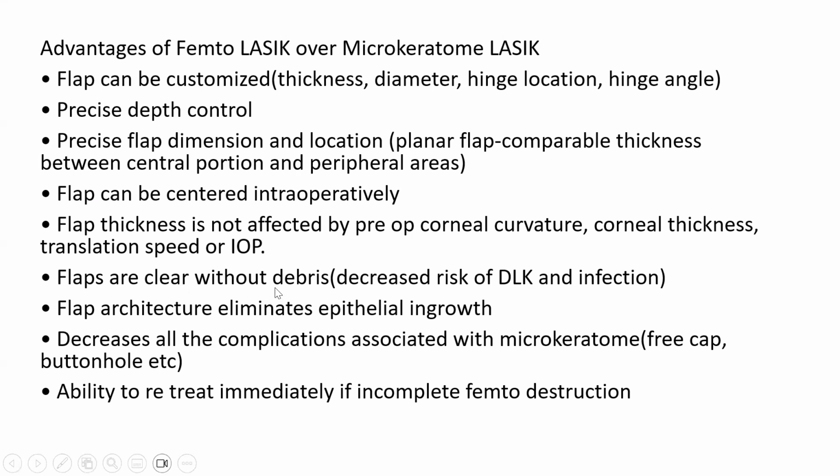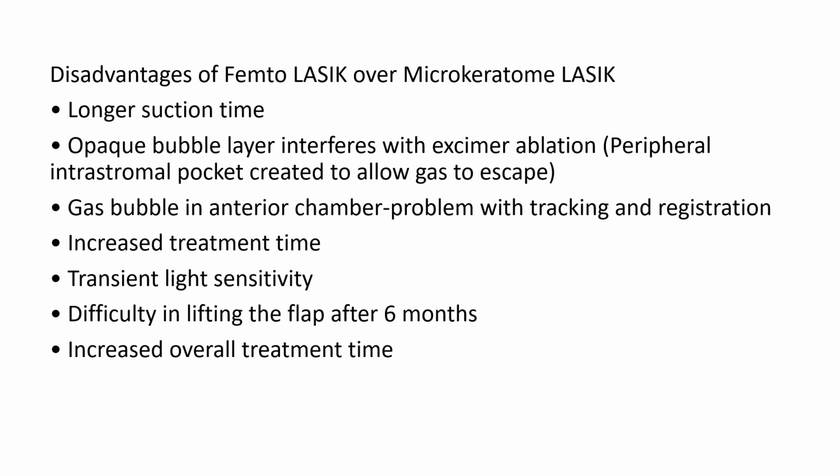The flaps are usually clear without debris, which leads to a decreased risk of DLK and infection. The nature of the flap itself is such that it eliminates epithelial ingrowth and decreases all the complications associated with microkeratome like free cap and buttonhole. Also, a huge advantage with using the femto to create the flap is the ability to retreat immediately if incomplete femto disruption occurs.